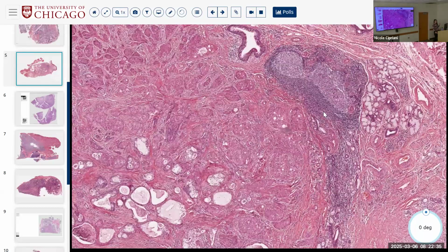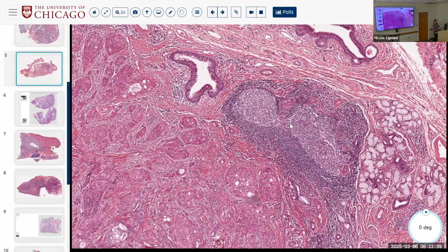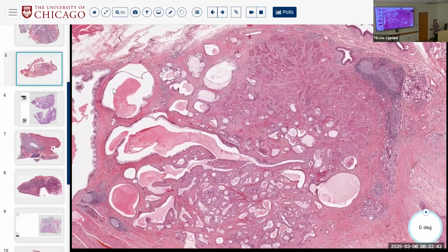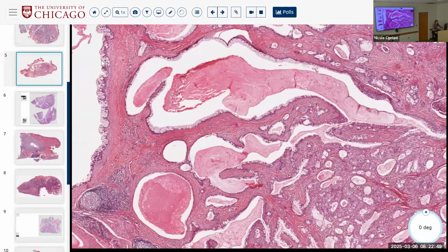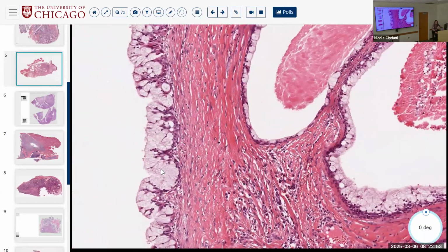So I'll do this one. We also have lymphoid stroma. We also have these very eosinophilic and cystic spaces, although the background stroma isn't quite as lymphoid rich, right? And so this is not necessarily one of the more challenging examples because we have an abundance of these cells, which are what? Mucocytes.